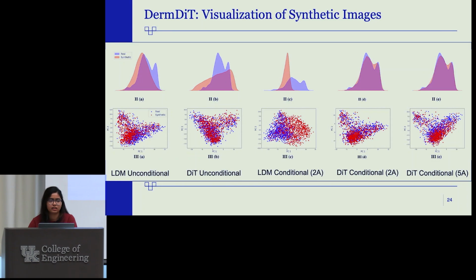If you have heard about the text-to-image models, some online text-to-image tools, where if you provide a caption, it will generate new AI images, those models are trained with natural images, but here it's only dermoscopic image based, it will only generate dermoscopic images.